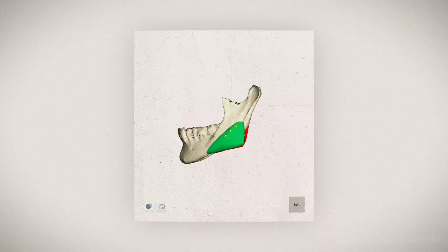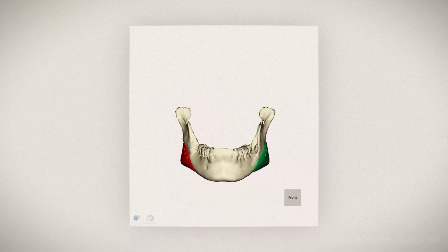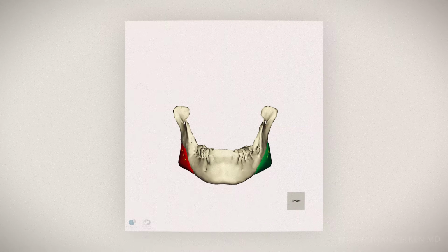What do I mean by that? An implant is really designed to enhance your natural skeleton by augmenting it. And when you put on something that's like a plastic or a rubber type of material that doesn't look or feel like bone, sometimes it can slide around and it may not be optimal.